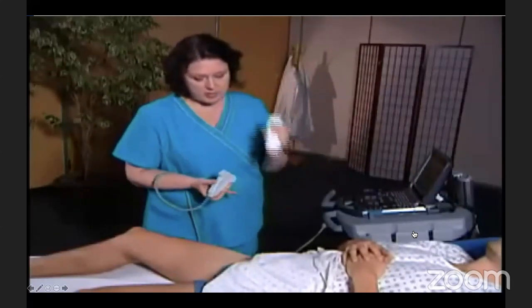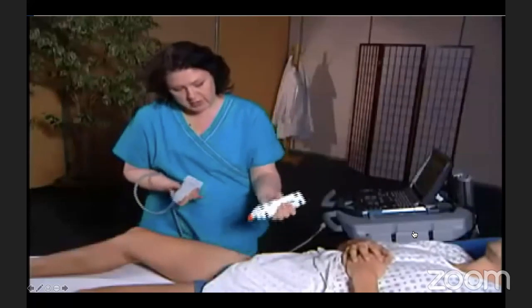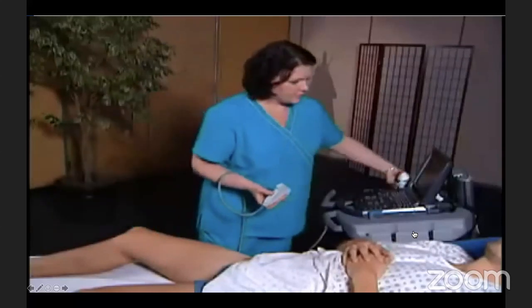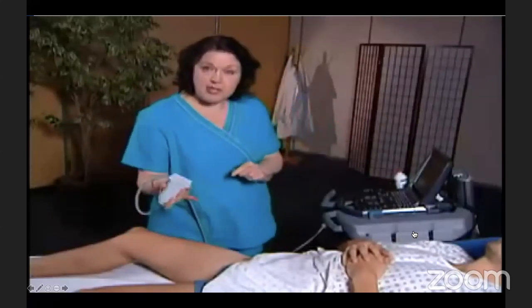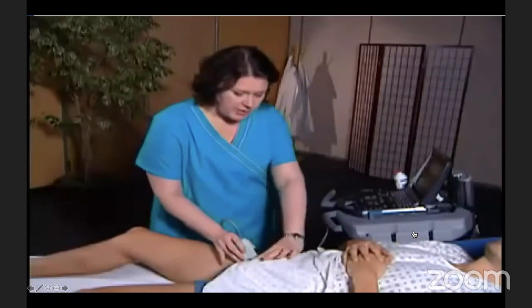When you do this, you're optimizing the system so it's automatically configured for your best resolution of the veins. We're going to use a little bit of ultrasound gel, and we're going to assess two areas, the femoral area and the popliteal area. I'm going to start with the femoral area. We're going to place the ultrasound transducer at the inguinal crease in a transverse view.